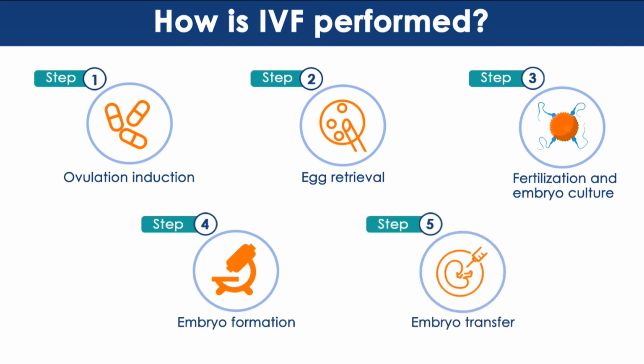Step 5. The last step of the IVF procedure is embryo transfer and implantation. The sturdiest embryos are then transferred via the cervix into the uterus for implantation. This is followed by complete bed rest to give the woman the best chance at conception.